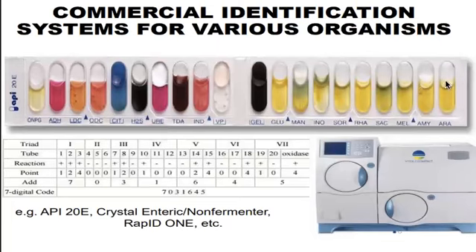No? So once na nalagyan mo na yan ng iyong inoculum, the next step is to place a layer of mineral oil. No? Mineral oil ang nilalagay to seal. Okay? Para hindi madisturbo yung ating reaction na pwedeng mangyari dun sa ating mini agars, no, sa baba. Ang cute niyan. Tapos i-incubate. Okay? After, edi pwede mo nang tignan, no, kung ano yung mga reactions. And then there's numbers. May numbering yung mga reactions nila. Ganyan. Okay? Tapos, no, titignan mo yung reaction.